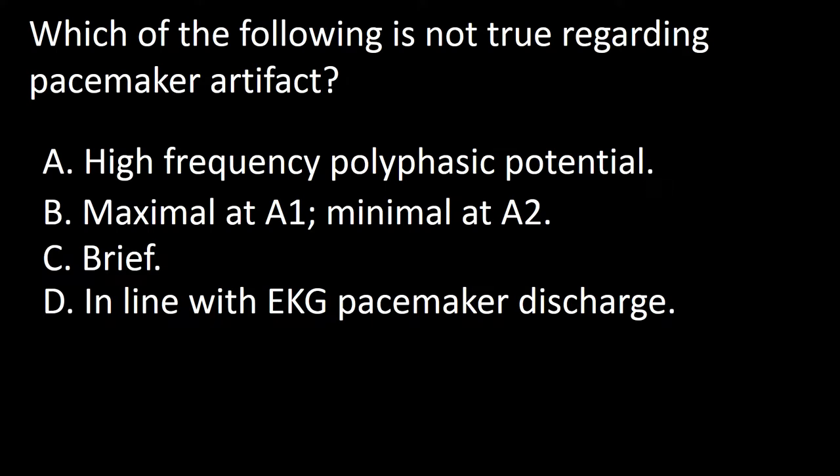Next question. Which of the following is not true regarding pacemaker artifact? A. High frequency polyphasic potential. B. Maximal at A1, minimal at A2. C. Brief. D. In line with EKG pacemaker discharge.